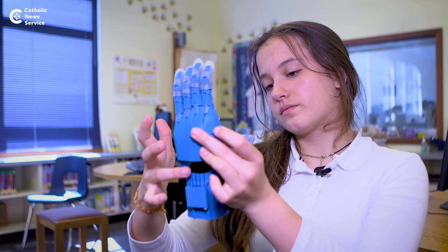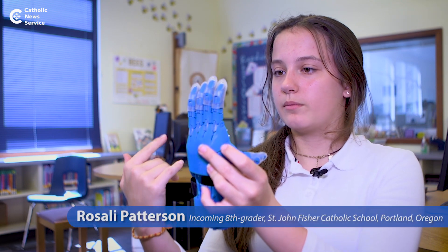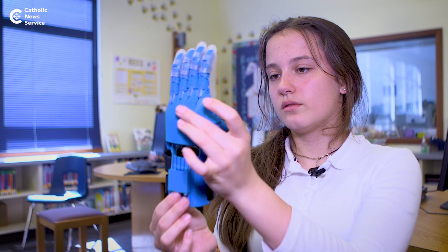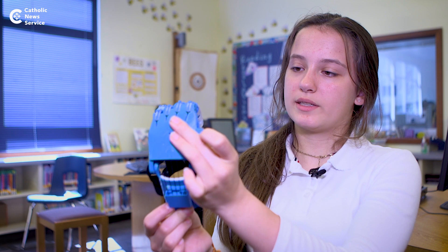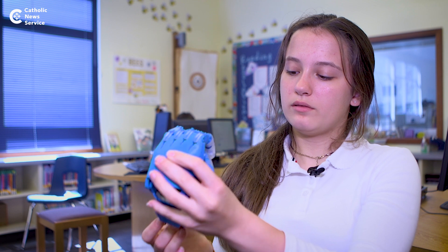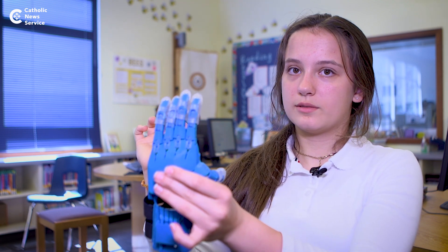These strings act like the tendons in your fingers so they can make them move. When someone pulls their wrist down, the hand closes and they're able to pick stuff up with the finger grips. And then when they want to let it go, they relax the wrist, and it goes back out.